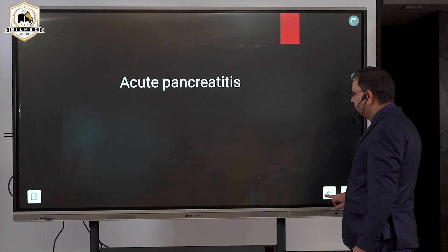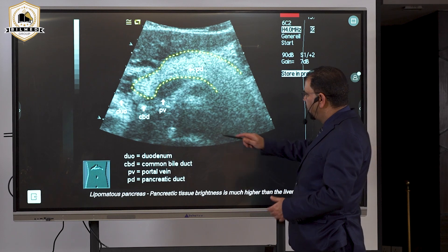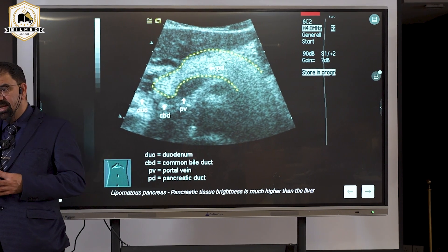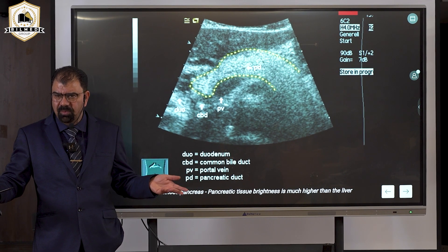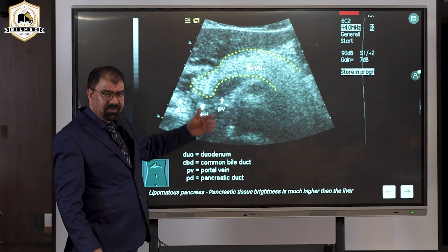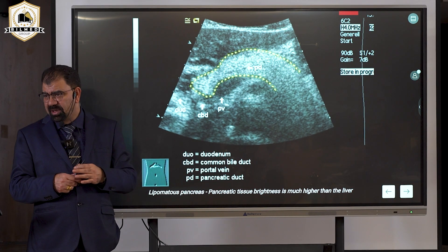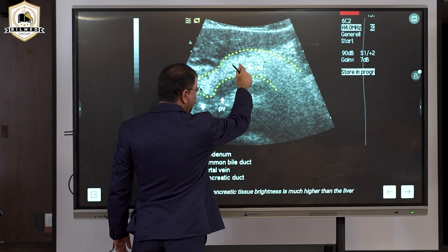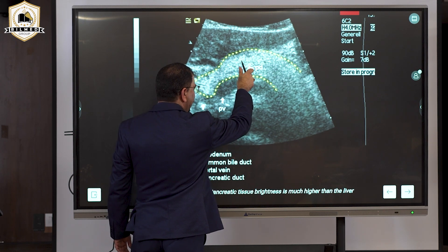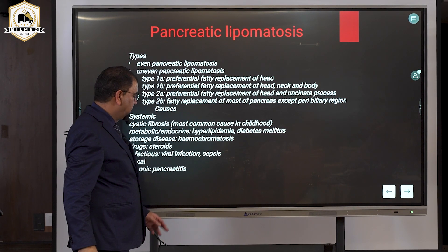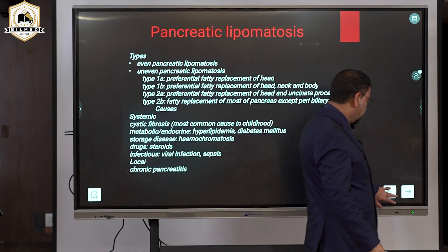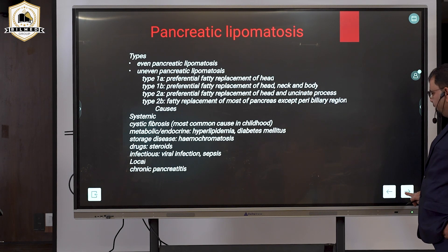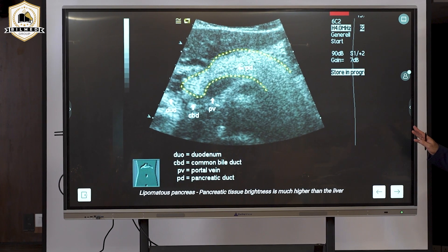In this picture, the pancreas is more echogenic compared to the normal pancreas — it is more echogenic even compared to the liver. If a part has less fatty deposition, it will look like a mass, similar to focal fatty sparing in the liver. So know that there is something called lipomatous pancreas, and if your patient has it, make sure they are aware of the diagnosis.